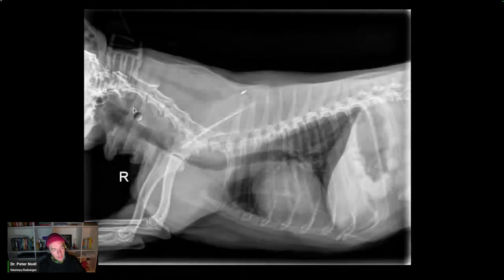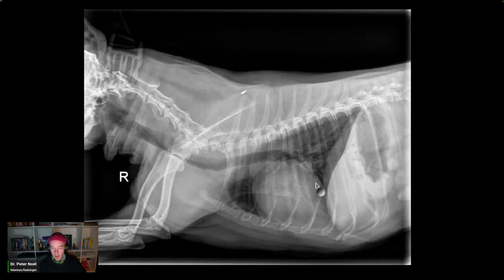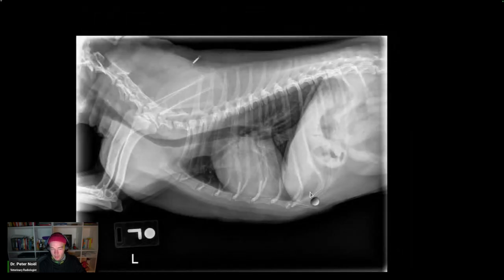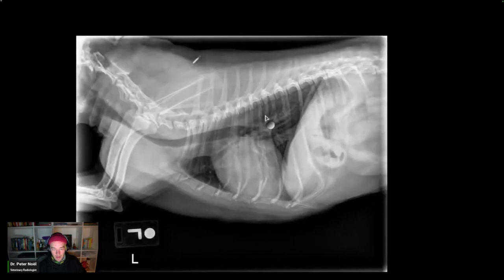Okay, so this I would describe as a broadly based, within the cervical trachea, there's a broadly based soft tissue opacity that attenuates over 75% of the lumen, and the degree of narrowing differs between lateral views. You quickly look over here to the principal bronchi, carina area, looking for collapse, and I don't have it. The patient is obese. The cranial abdomen is normal. The cranial mediastinum is within normal limits. I look at the pleural space right here. I look for thoracic lymphadenopathy right here.